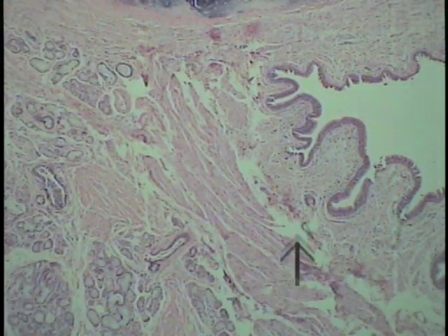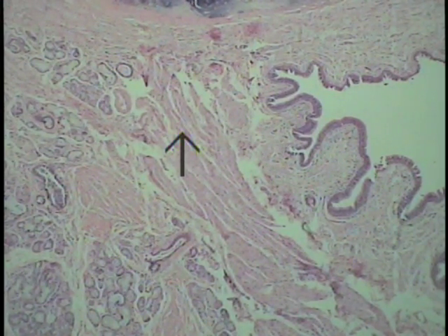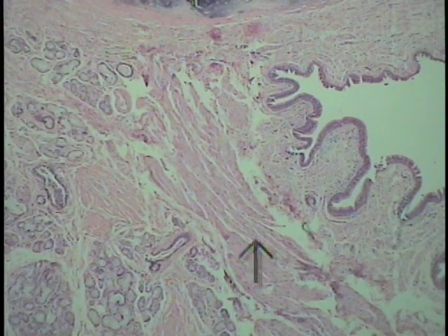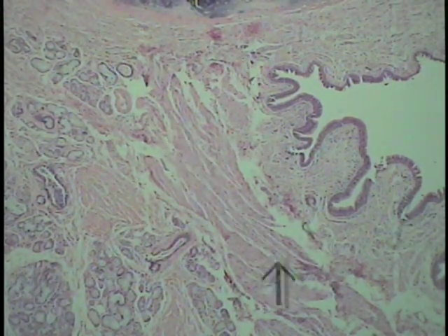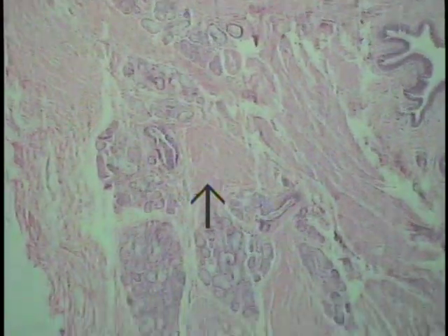What it functions to do, it appears, is unite the ends of the horseshoe-shaped cartilages that are in the tracheal wall, keeping it patent, and the open ends of this horseshoe of tracheal cartilage are united by this huge smooth muscle band known as the trachealis muscle.